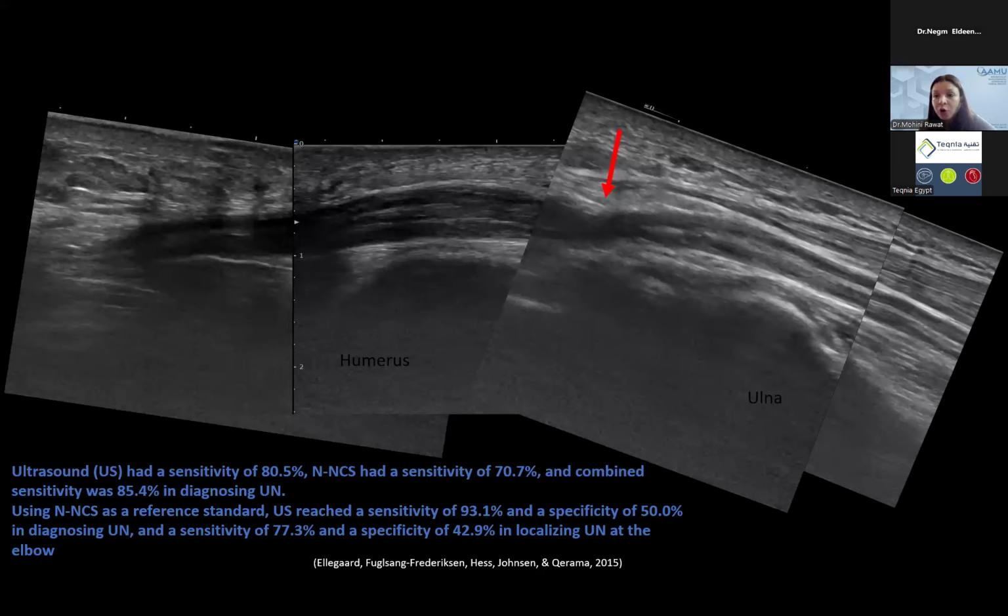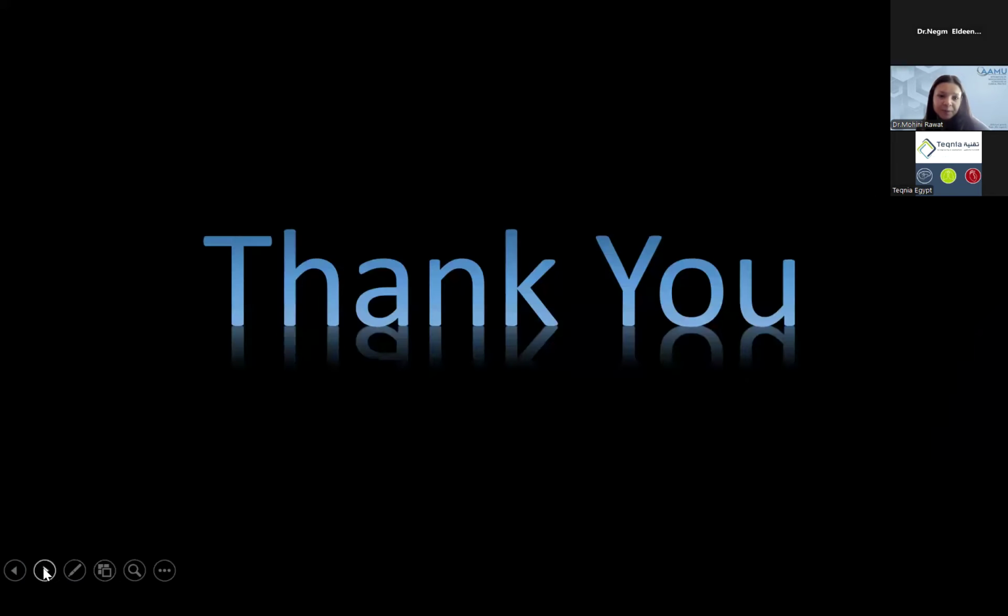you learn a lot more, because EMG will tell you the electrophysiology or function of the nerve. Ultrasound will tell you the structure of the nerve, or structurally what's going on. It may not always give you the details of the pathophysiology or electrophysiology, but it will tell you the structural changes. And some of the structural changes can be attributed to different pathophysiology happening in different disease processes. So both of them together are pretty strong tools in the diagnosis of peripheral nerve disorders.